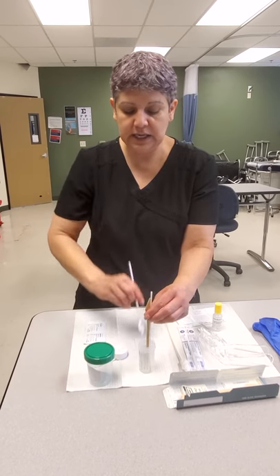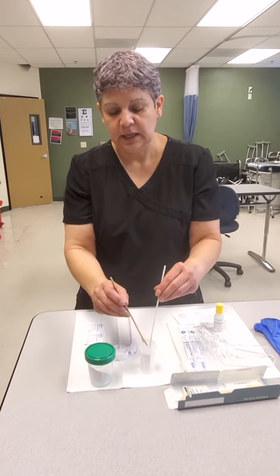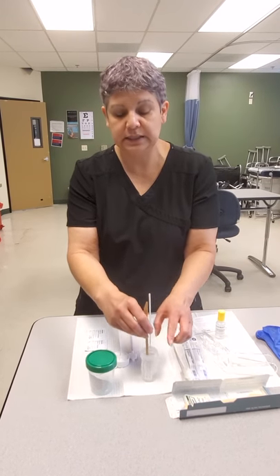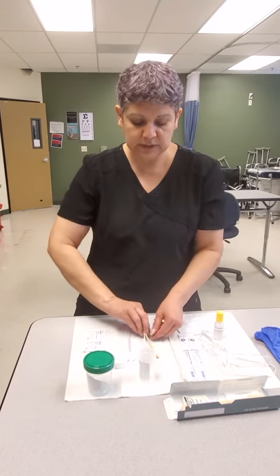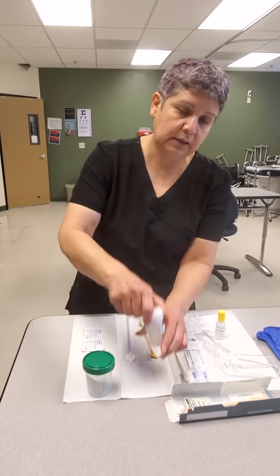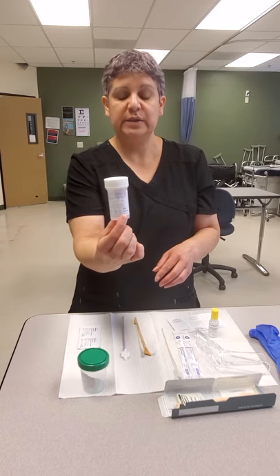I like to take my spatula and scrape the cells off of my cytology brush to make sure I get as many cells as possible. Once done, I close the jar and it will be sent off to the lab.